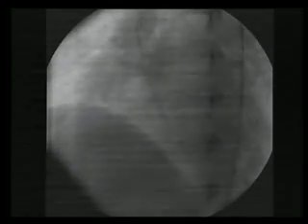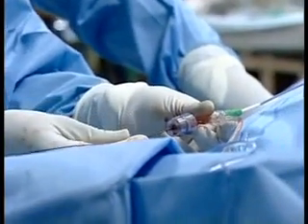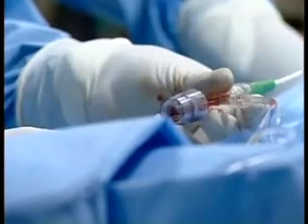This single 6 millimeters is on the LV side, is it? He said it is 6 millimeter on the LV side. If you look at the device, it's a double disc with the central cylindrical part. Ideally speaking, the central cylindrical part is supposed to sit on the VSD, that tunnel-like VSD which you saw. And that is supposed to sit there. He is supposed to seat it within that.